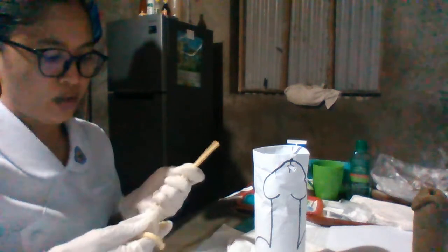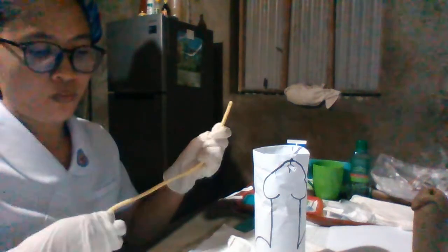We will know that by inserting the syringe with fluids into the catheter, to know if it is working.